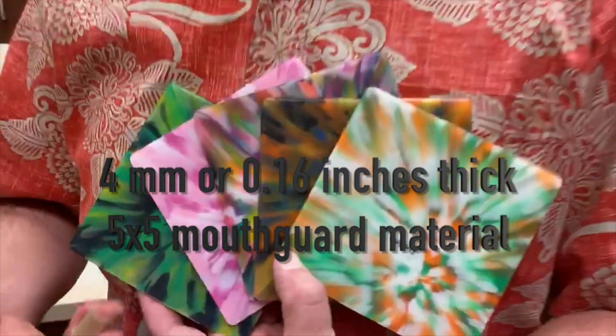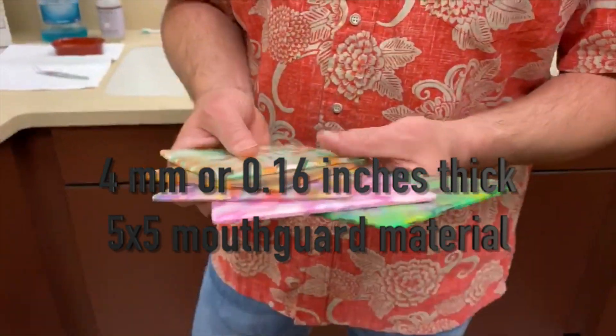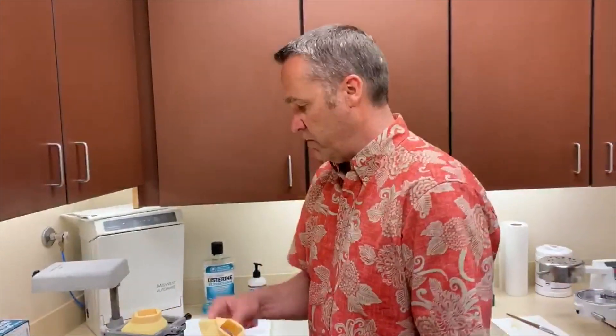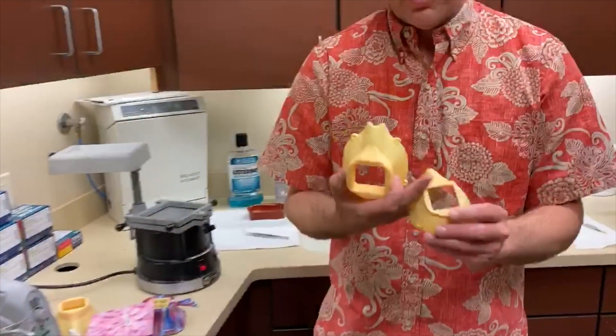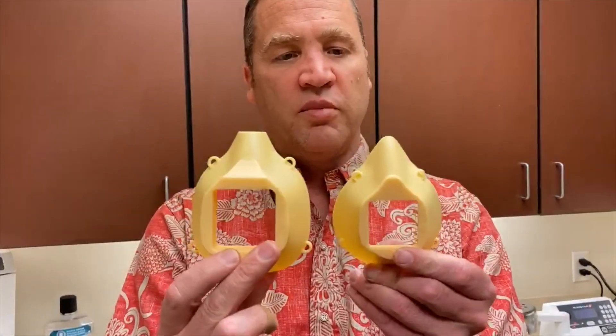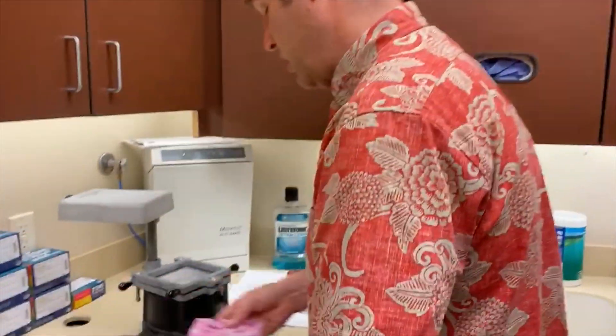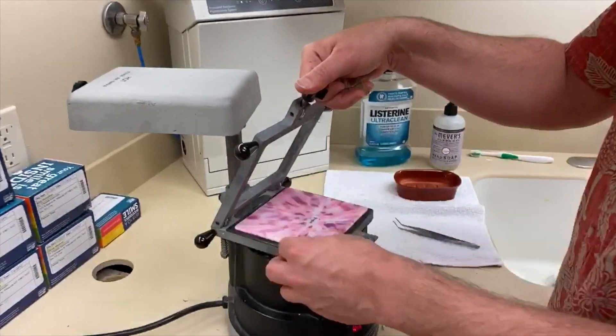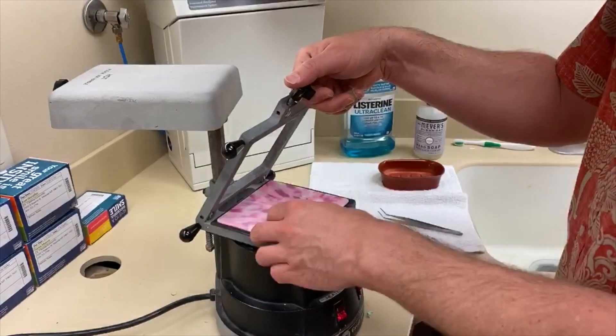We ordered a bunch of mouth guard material in cool colors because we like tie-dye in our office. We have different sizes — this size mask fits a big face like mine, and then we have a smaller size for people with smaller faces. You can see these prints — we have one for a big face and one for a small face. I'm going to do the same process with the small face, and because Aaron likes pink we're going to do hers in pink.